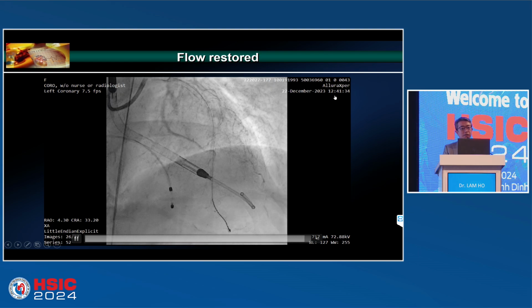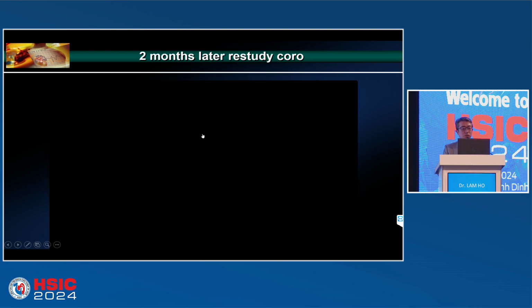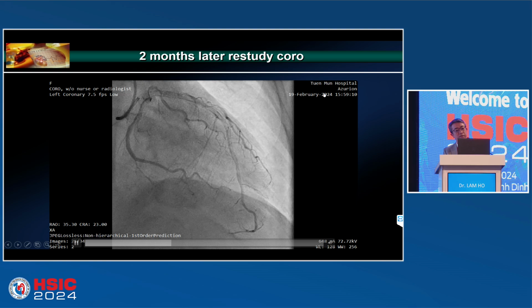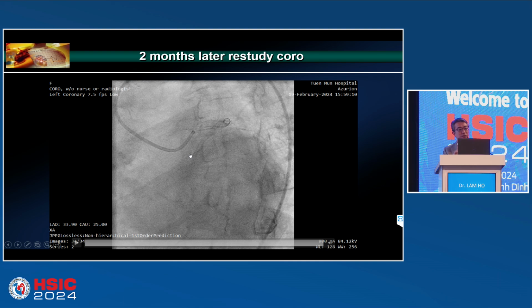And 10 minutes later, while the Impella keeps functioning, keeps the hemodynamics, and we continue to give some drugs, the flow is established and the pulse improves a bit. So the flow was restored, and the patient was safe, no hypoxic brain injury. So you see the full record, 1 minute, we finished the Impella. And this is the repeat angiogram 2 months later. Now everything is okay. So you can see how terrible the lipid-rich part is that induced the no-reflow.